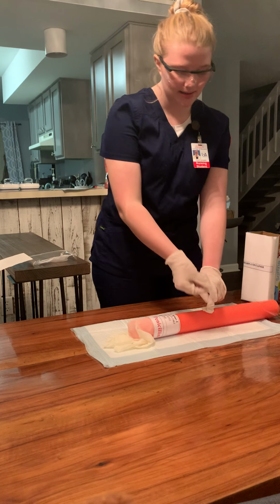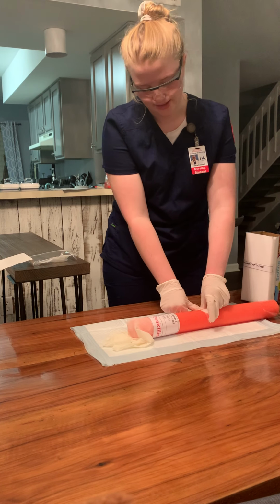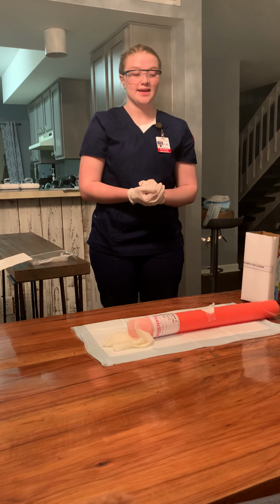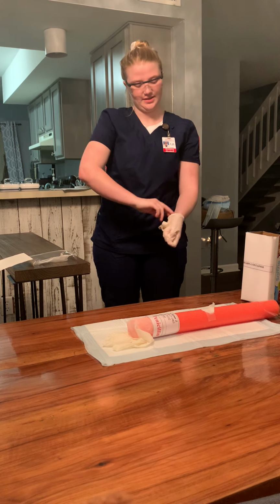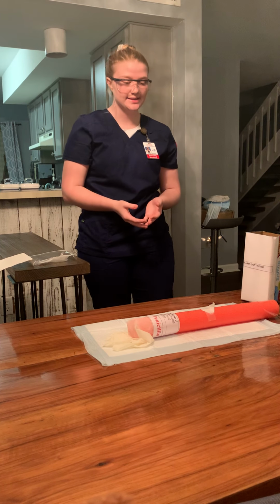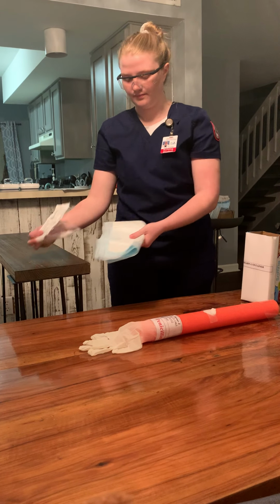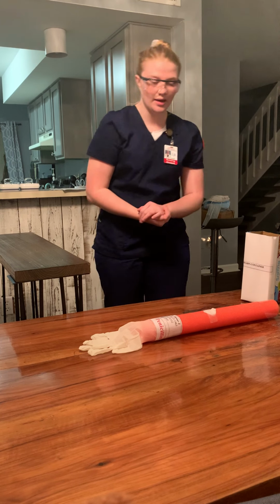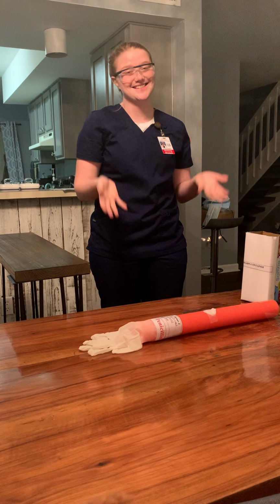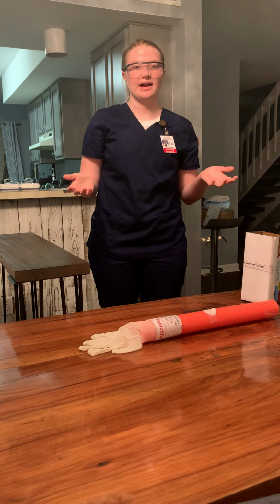would have a piece of tape and I would apply it over the gauze and leave it, and then I would of course remove my gloves, glove to glove and skin to skin, clean up my mess. Perform hand hygiene, raise the side rails, lower the bed, and make sure the patient is comfortable. And that completes my IV insertion checkoff.